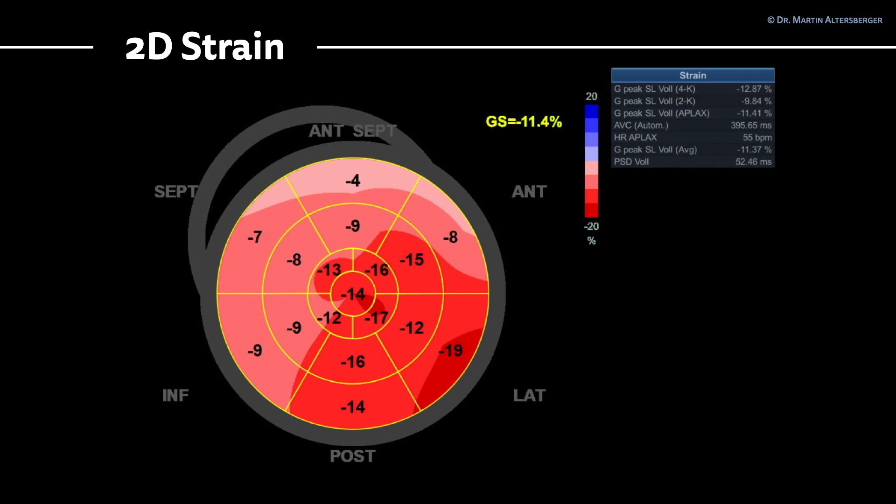You can see some regional patterns: septal and inferior regions show less contraction, while lateral and posterior regions show more contraction. The dark red indicates normal longitudinal contraction, and the lighter the color, the less longitudinal contraction is present.